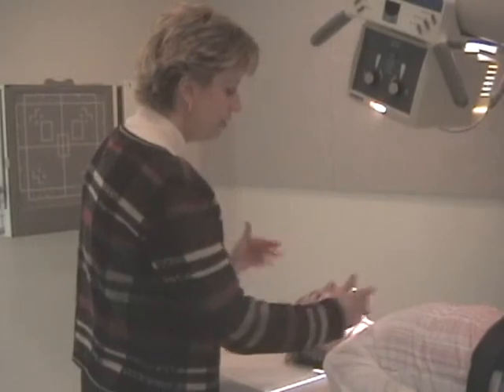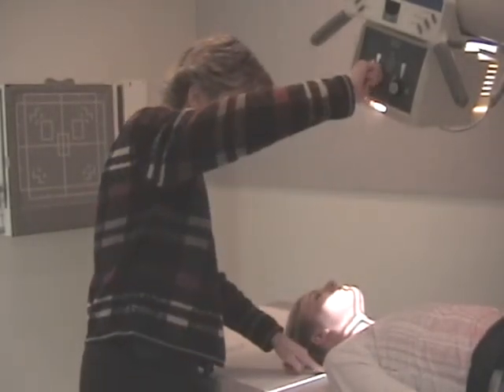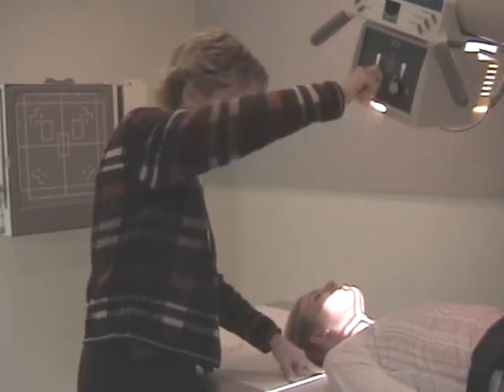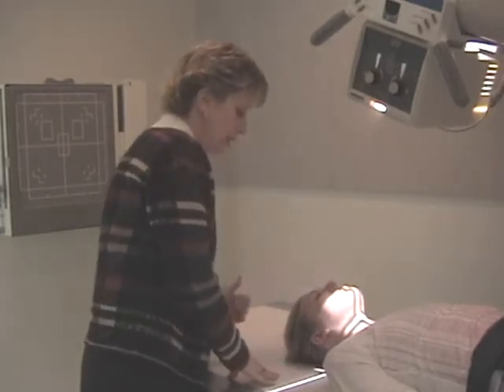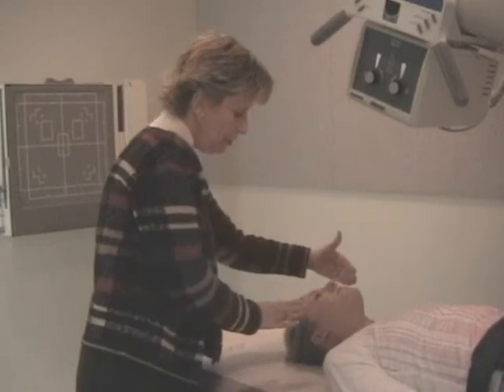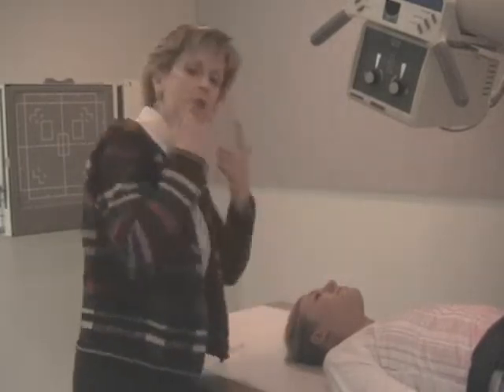You have 10 inches of collimation lengthwise, and side to side will be dependent on the patient's neck size. Come in fairly close, but do not clip pertinent anatomy. Step to the head of the table and make sure that the patient's face is in a true AP position. Make sure it's straight and that the distance from the outer canthus to the cheeks is the same on both sides.